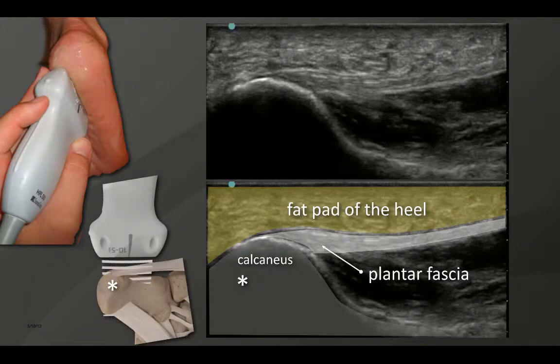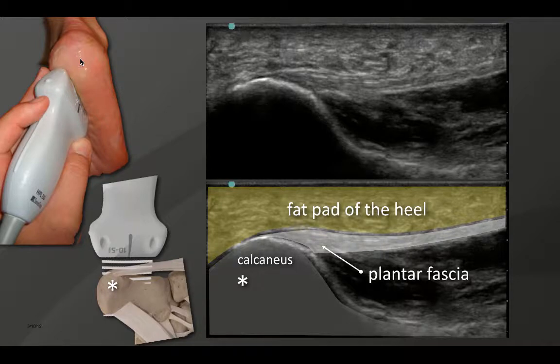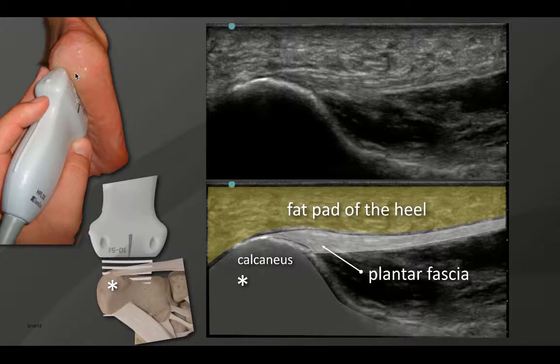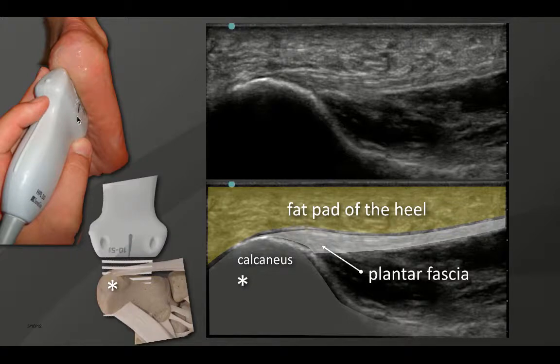Plantar fascia. The scanning pearl is not to scan midline in the heel. If you scan midline, your transducer will sit between the lateral cord — which goes to the base of the fifth metatarsal — and the medial cord, which is the one that everybody typically has injuries to. You want to stay on the medial calcaneal tubercle. Notice in the photograph we're leaning the transducer medially but aiming the beam back towards the calcaneus. You can't just take a perfect sagittal slice or you'll get only soft tissue — you have to aim the beam back into the calcaneus to get the proper image.